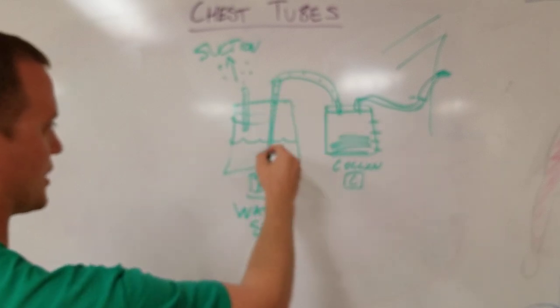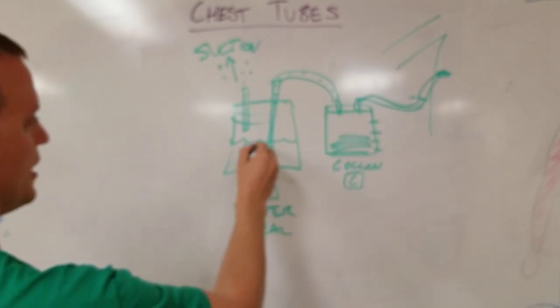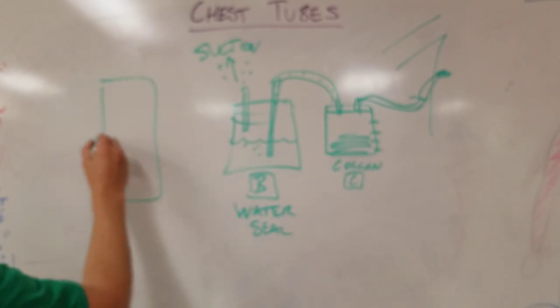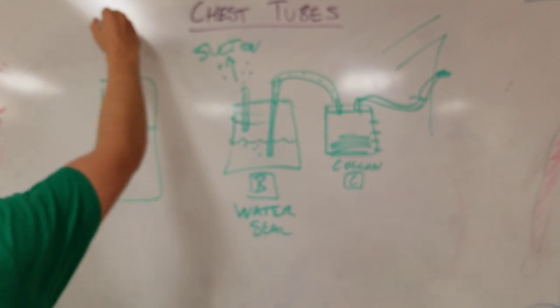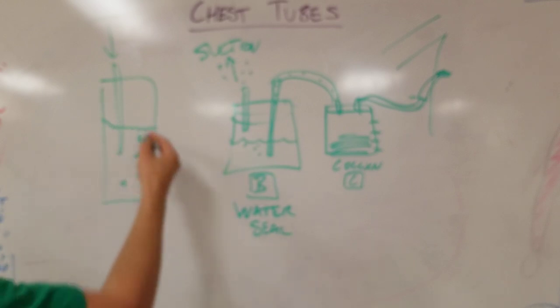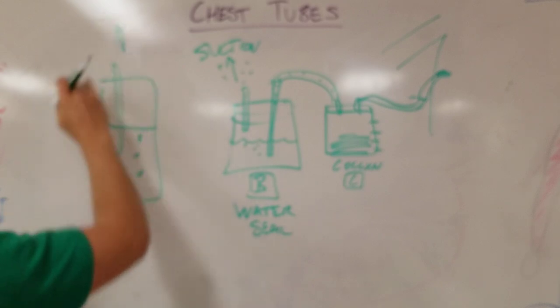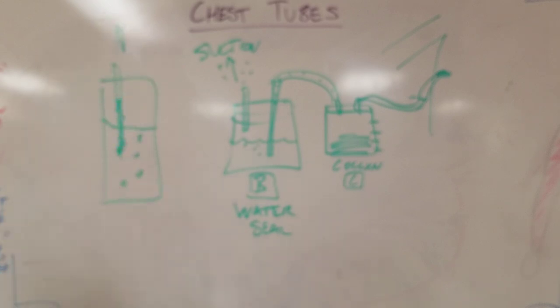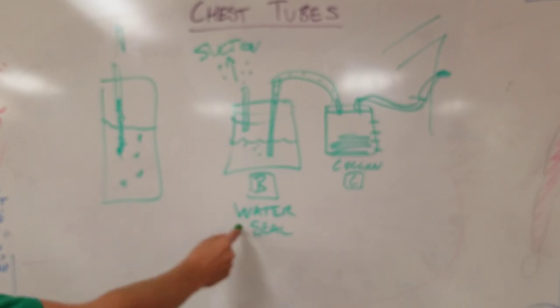Now, if air wants to come this way, no problem. It can bubble through, right? Think of when you were a kid at a restaurant and you put a straw in a glass of water. You're messing around, and you blow. If I blow, I make bubbles. Conversely, if I tried to suck in or aspirate through my straw, water would rise up my straw, but no bubbles would. So what you're effectively doing is creating a one-way valve that prevents any air from going back in the chest. This is a water seal.